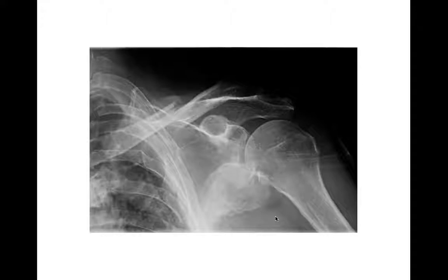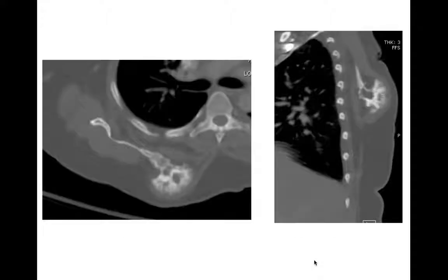Moving to strange lesions of the scapula. Here we see a sclerotic lesion arising from the scapula — this one turned out to be an osteosarcoma, a strange place for one but they can occur there. The fracture was incidental. Chondrosarcomas are lesions that can occur off the scapula and are not uncommon. Remember mets, multiple myeloma, and plasmacytoma. Osteochondromas are another lesion that can occur off the scapula.